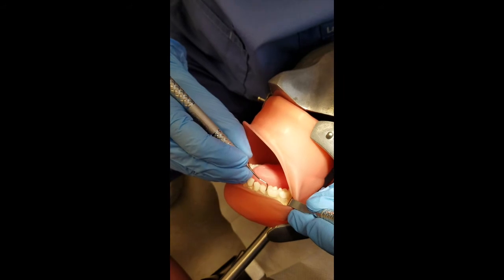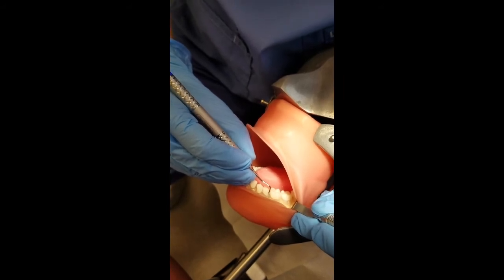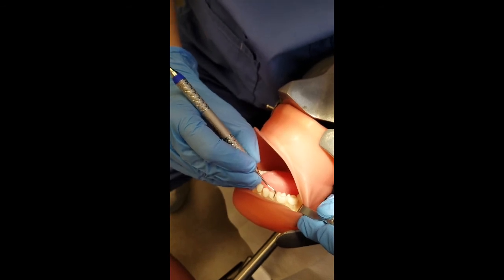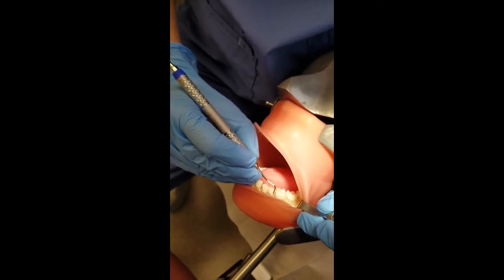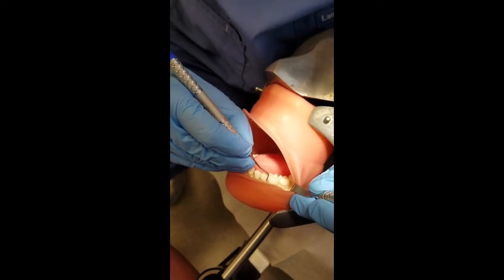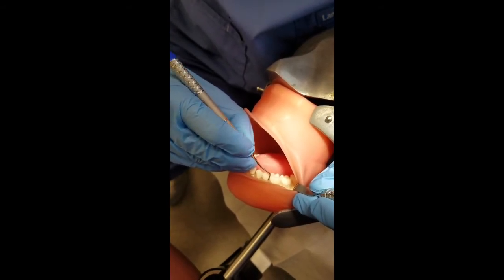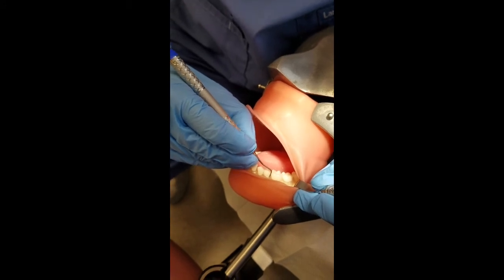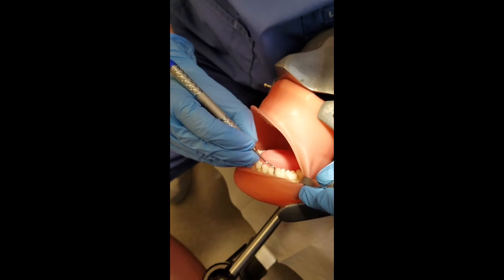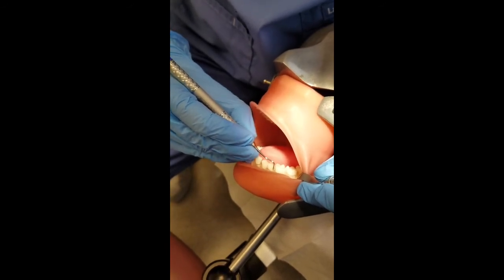To do the mandibular tooth, you're going to start at your Get Ready zone, which is the middle third of the crown, just 1 stroke before the line angle. Make sure that the tip of your instrument is facing in the direction you are going. You're going to do a distal rock with no lateral pressure to explore until the terminal shank is parallel with the long axis of the tooth. Then you will tip the terminal shank 70 to 80 degrees towards the tooth and activate your lateral pressure in order to scale.